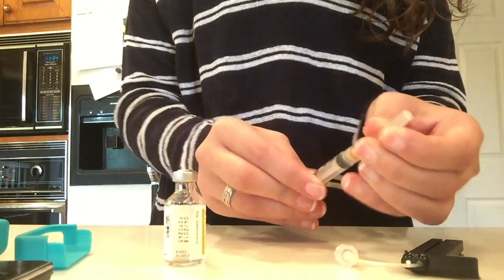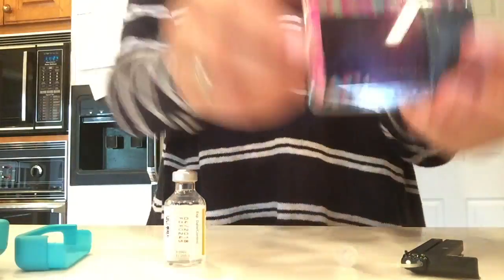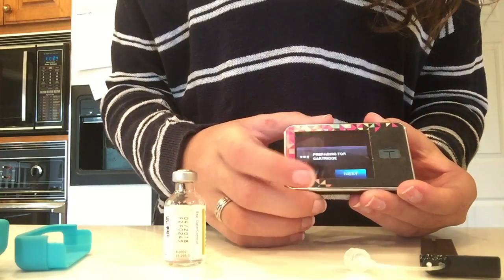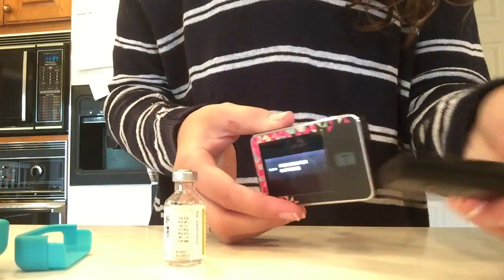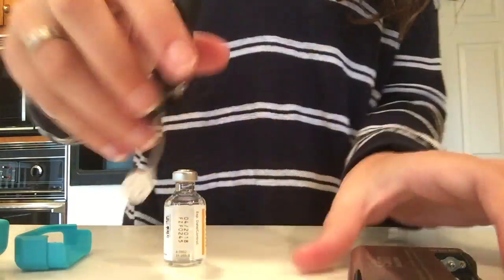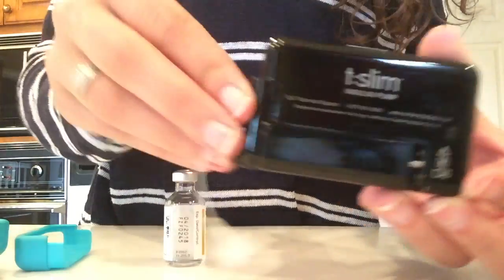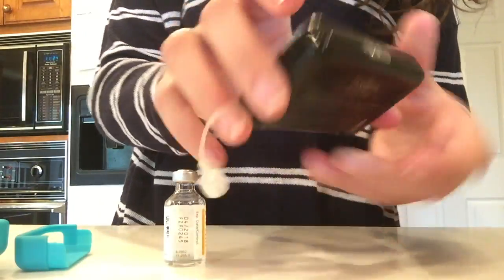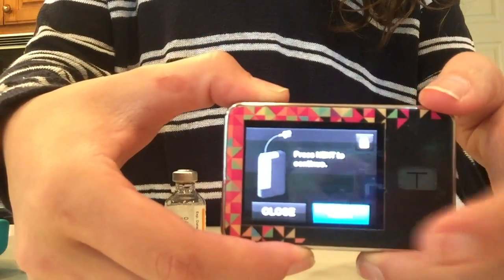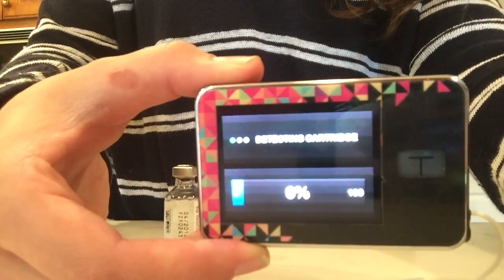Then I put the cap back on the needle and untwist the needle from the syringe. I take my pump and turn it back on, unlock it, and hit the next button — it's preparing for the new cartridge. Then all you're going to do is slide the cartridge onto the back of the pump. There's a little ridge on the pump and a little divot on the cartridge and they line up and it slides in there nice and tight. You will hear a click when it is attached, and then you're filling the cartridge.